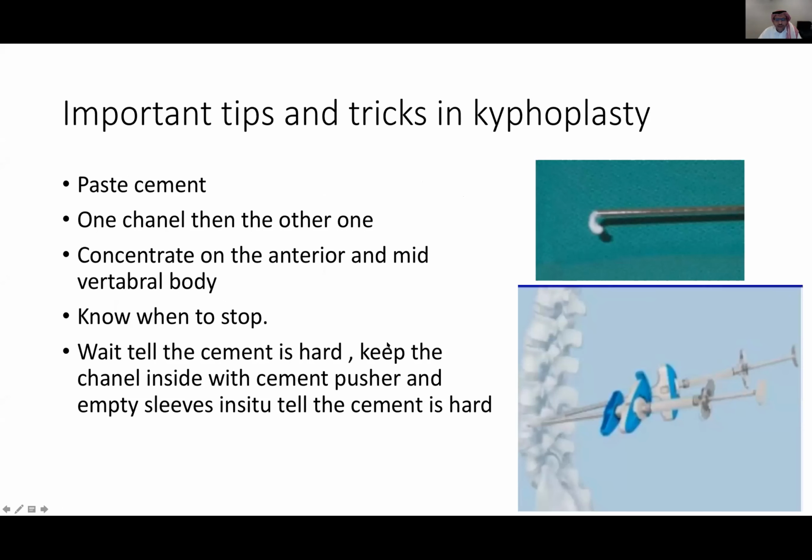Now, please, as Prof. Majed and Dr. Khattab mentioned, make sure about your cement. When you prepare the cement on the table, make sure that it is pasty. Okay, don't be rushed and go and inject a fluid cement. This is one of the problems, that it can leak somewhere. So make sure the cement is pasty. And this is very important.